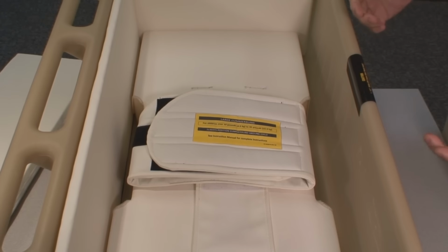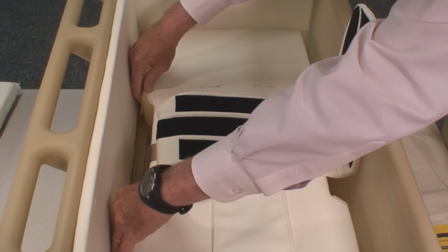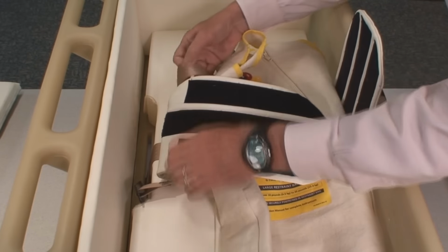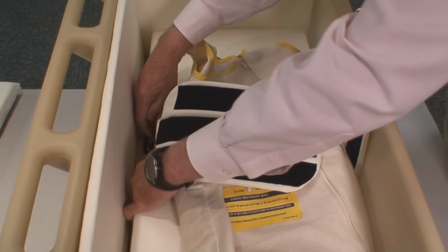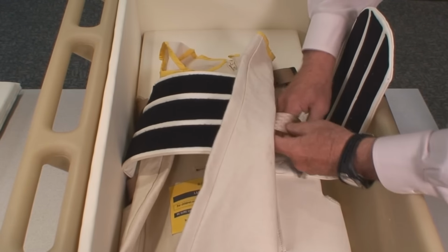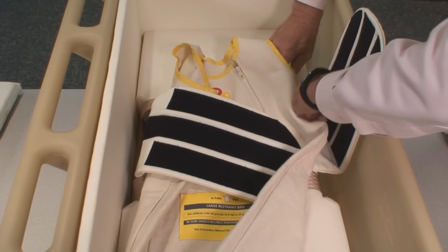Now you're ready to install. Okay, we're now ready to install the restraint bag. The 1.5-inch EPS foam has been removed, and we'll move the 3-inch foam cushion this way, and lay the restraint bag on top of the cummerbund, and insert the metal anchors into the slot on this side. Move the 3-inch cushion this way, and we'll insert the metal anchors on this side. When you insert the metal anchors, you're going to have to compress the cushion down in order for the anchors to be put in place.